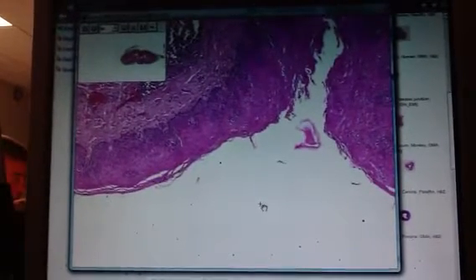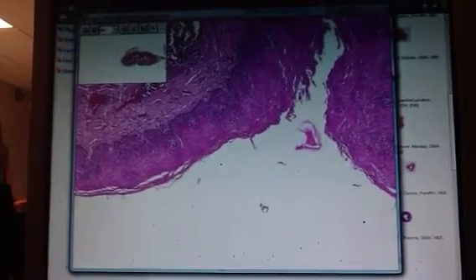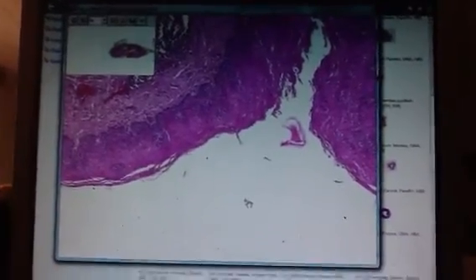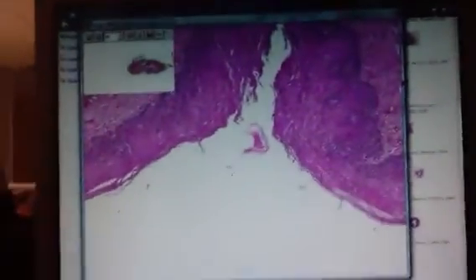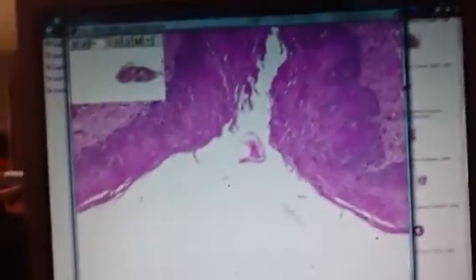Remember, we're putting pieces together. So most of you won't have a clue what a connective tissue, what a muscle, or what something else looks like. For now, it's just kind of learning what the heck an epithelium is. Okay? Would you not say, looking at this, that this stuff, or this stuff, has a free surface?